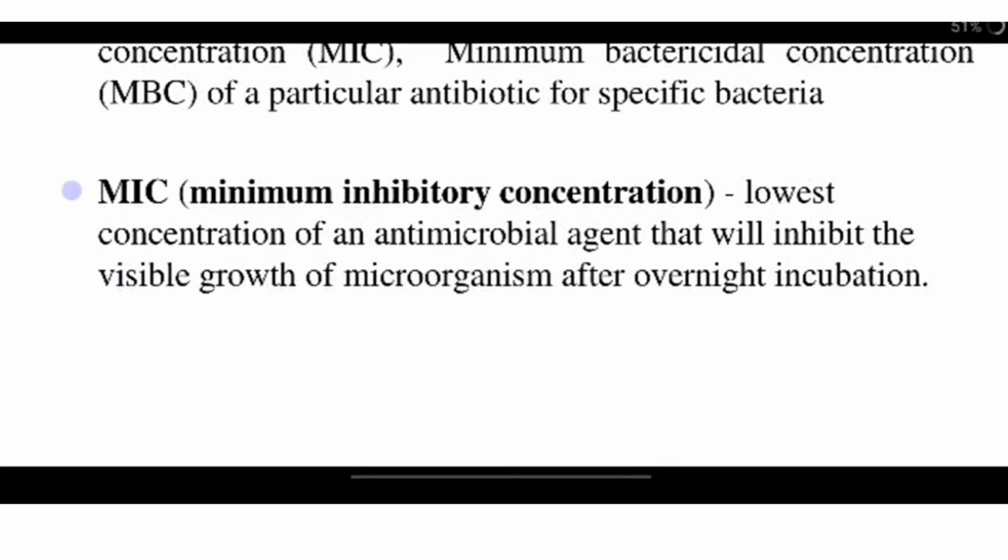after overnight incubation. So there is a difference between the MIC and MBC, and the difference is that in the minimum inhibitory concentration, we can decide that there is no visible growth. There is a difference between visible growth and no growth of bacteria.